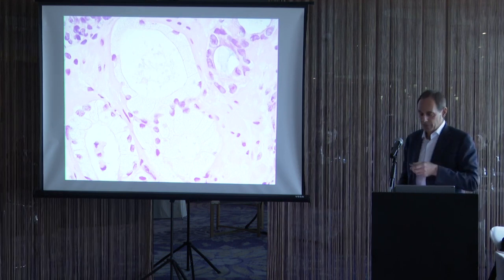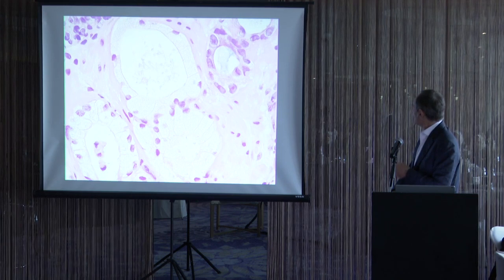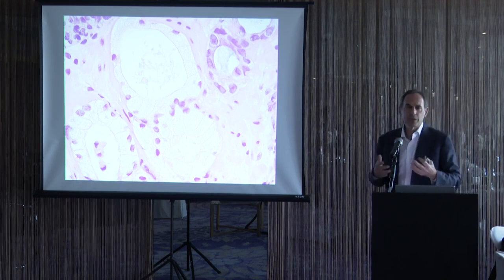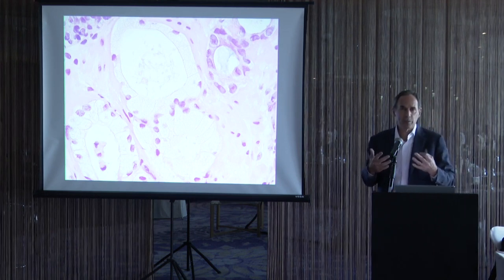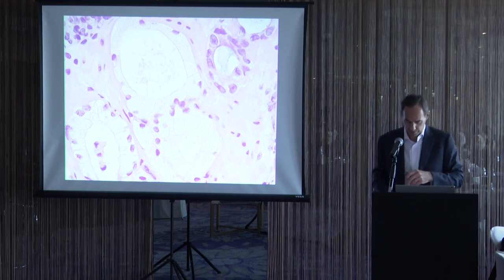But what you also notice in foamy gland cancer is that if you see usual prostate cancer adjacent to the foamy gland cancer, the usual cancer will have prominent cytologic atypia, but abruptly when you get to the foamy gland cancer, there's no cytologic atypia. So there's something unusual about that foamy cytoplasm that it's typically associated with just very bland cytology.